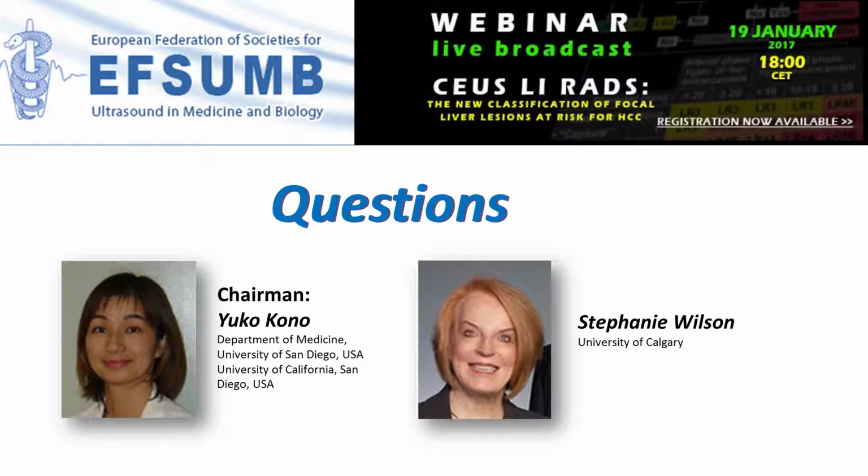So when it comes to questions about contrast agents, we have to recognize that we don't all use the same contrast. In Canada, I have used DEFINITY from Lantheus Medical Imaging since our introduction of CEUS in Canada a long time ago.